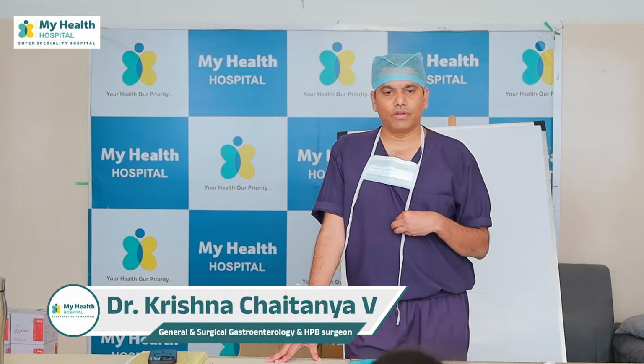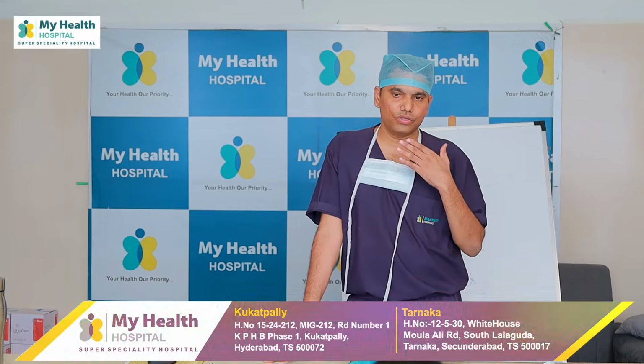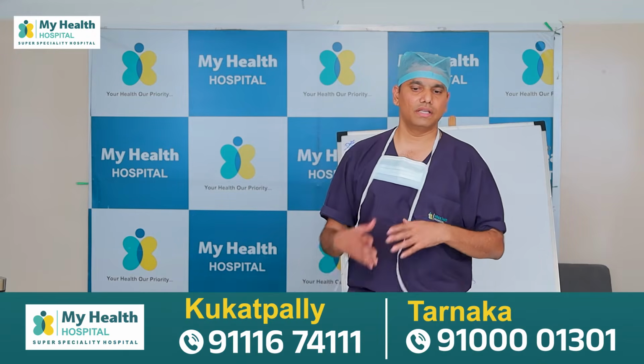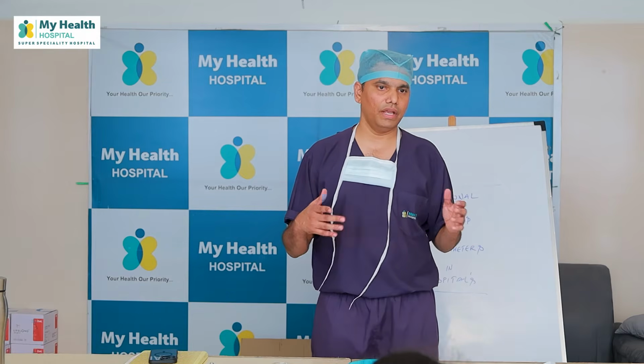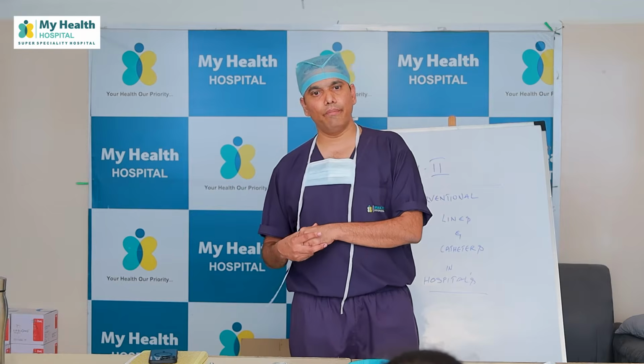Why will they aspirate? Because when CPAP or BiPAP pushes air, one third of the air also goes into the stomach, because it is an easier way to go there. When the patient is not taking synchronous breaths, it will push air into the stomach as well. So the stomach will get bloated. When the stomach gets bloated, in an already sick patient, he will burp it or he tends to aspirate. To prevent aspiration, we keep a Ryle's tube and connect it to the bag.